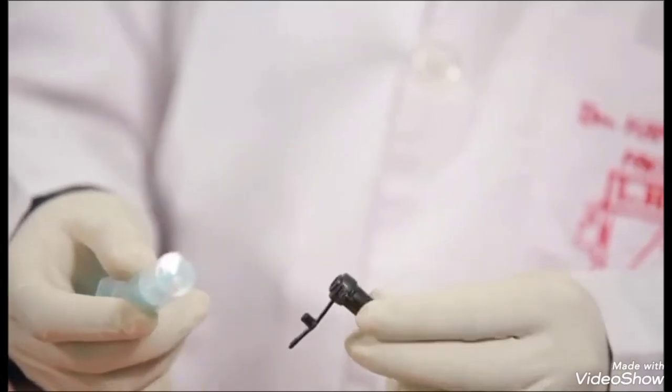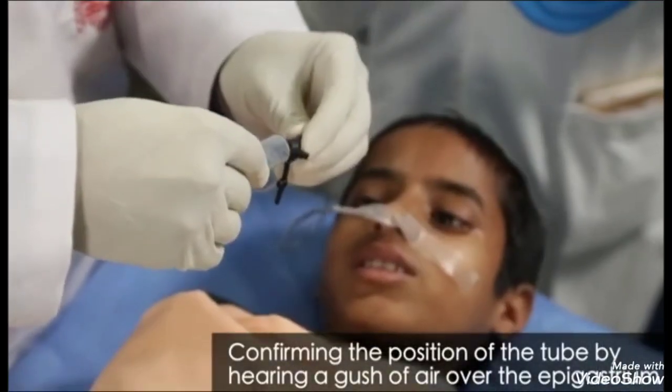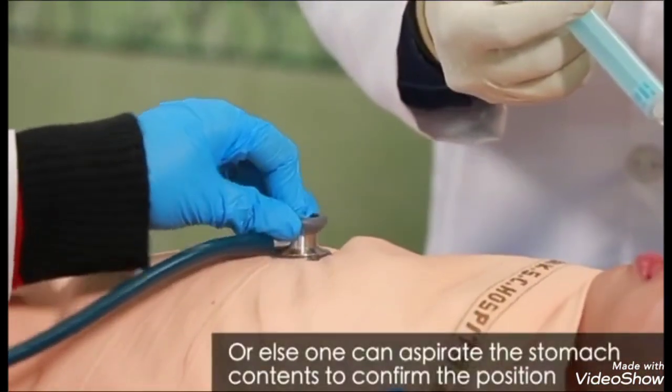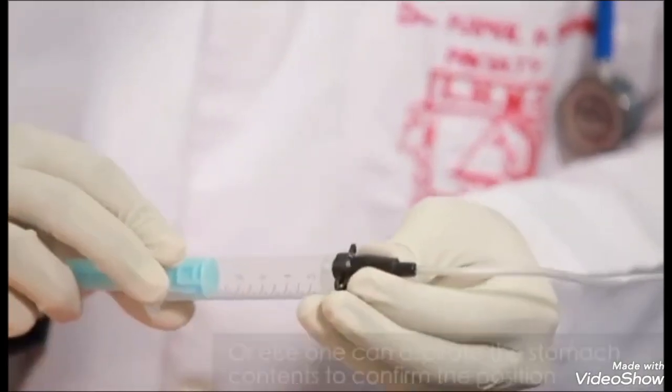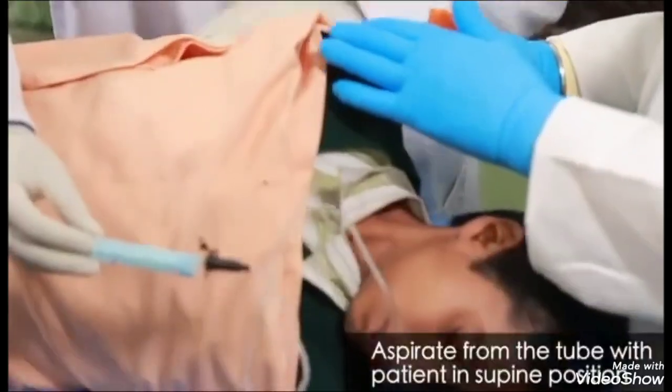Once the Ryle tube has been inserted into the stomach, its position can be checked by hearing a gush of air over the epigastrium. We can also aspirate the stomach contents to confirm the position. Gently aspirate from the tube, keeping the patient in the supine position.